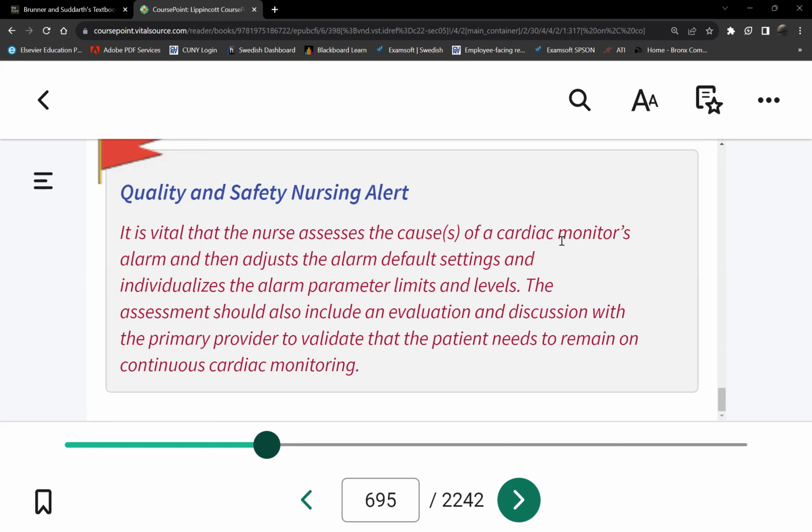All right, because patients tolerate dysrhythmias uniquely. Not all patients will look the same. So let's say I have a patient with VTAC. That's a dangerous rhythm. I go, patient sleeping, snoring. Okay, but then the monitor is showing VTAC. So always check your patient.